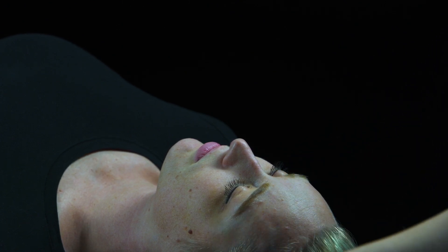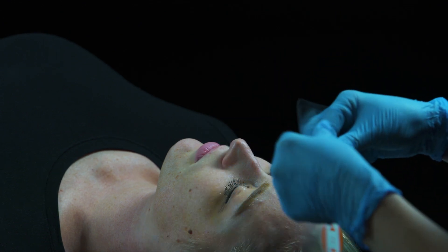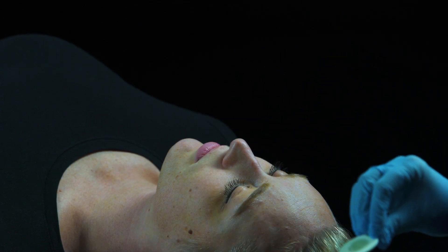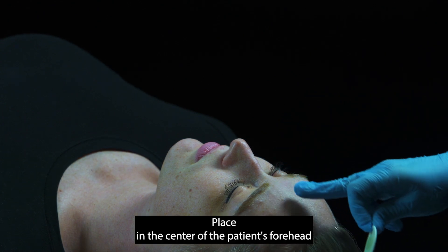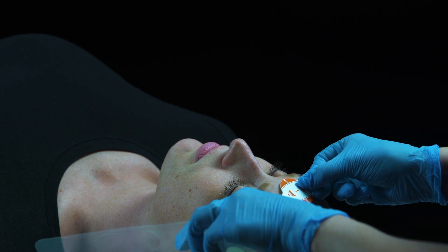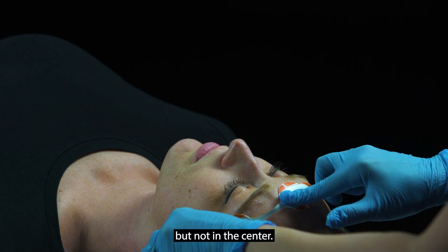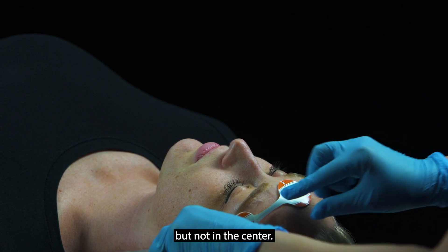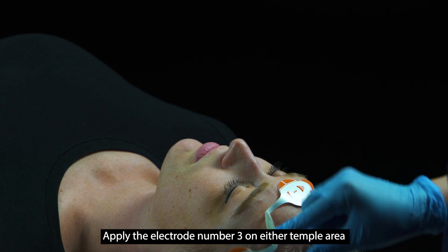Start with electrode one: place it in the center of the patient's forehead, 1.5 inches above the nose. Secure the electrode by applying gentle pressure around the edges but not in the center.